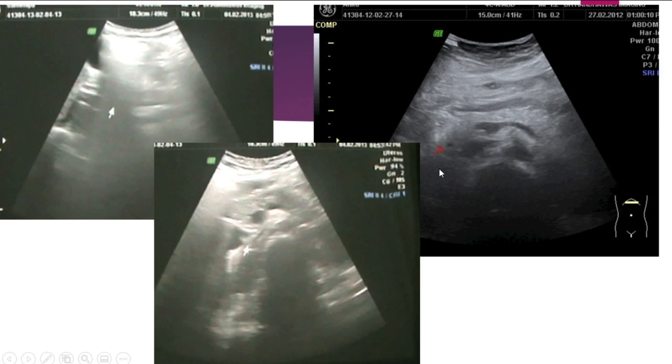This is the CBD. Now sometimes it may be a little bit tubular depending upon probe position, because a little bit of rotation may make the circular area a tubular area. And here you can see the CBD. Here is the IVC, and this is the portosplenic vein complex.